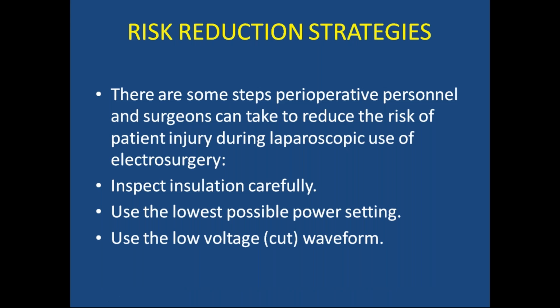So, risk reduction strategies. There are some steps perioperative personnel and the surgeon can take to reduce the risk of patient injury during laparoscopic use of electrosurgical devices. That is, inspect insulation carefully and use the lowest possible power setting. Use a low voltage waveform.